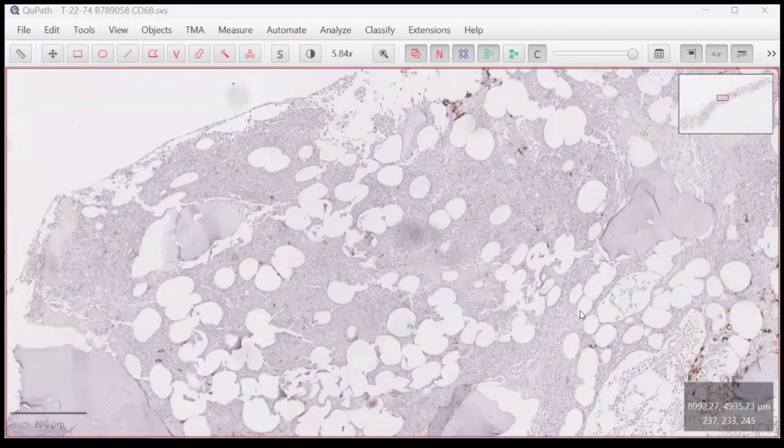If the staining they express CD68, they are normally, classically, and theoretically, they are CD68 positive. But then when you stain with CD14 and CD163, then you can see the differentiation. CD163 will stain more towards the immature one, and CD14 will show the matured one, meaning they are showing differentiation. So in this case, they are really helpful to have CD163 and also CD14.